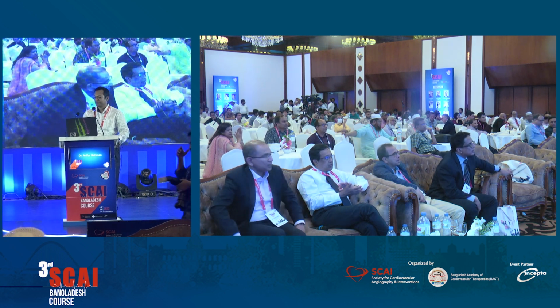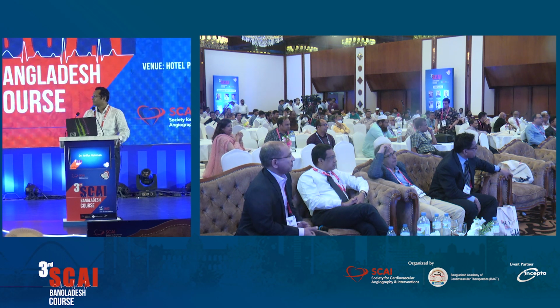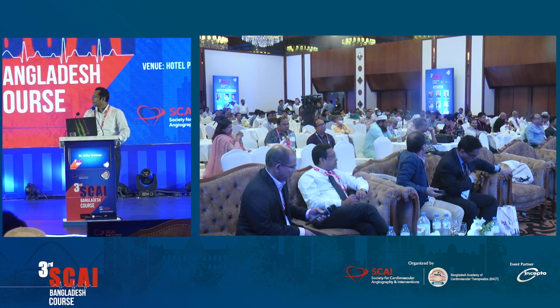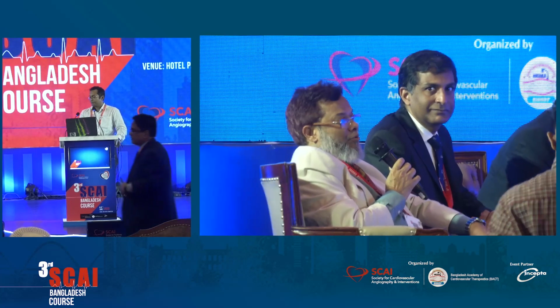Arif, for your brilliant case and nice demonstration, as well as the innovative procedure, meaning the making of a snare by hand. So we must congratulate you. But did you take any radial angiogram after the procedure, to see whether the radial artery is patent, whether the radial artery is all right or not?